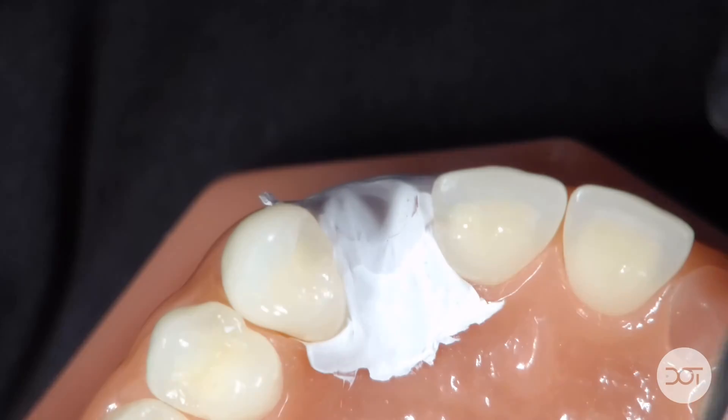For this case, the rib bond is already pre-cut and selected. For clinical cases, you must measure and cut the rib bond appropriately before placement. A common mistake is bringing the material straight across between the two proximal teeth — it'll look like that when placed flat. The problem is the rib bond will be too palatal, and you won't be able to contain enough composite for the pontic. This can cause the pontic to break off because the rib bond isn't supportive enough.